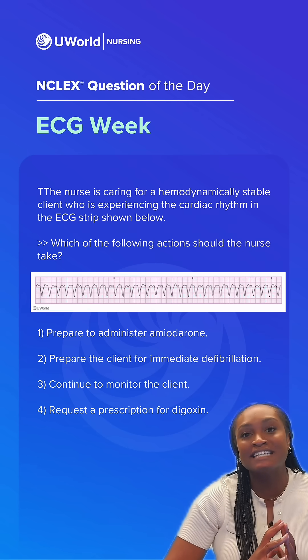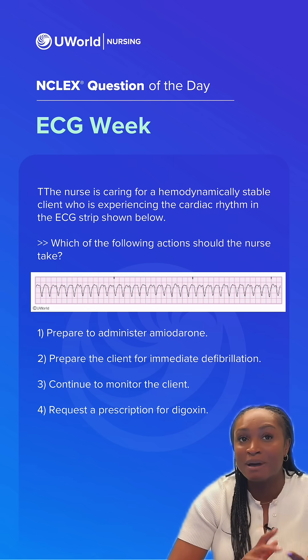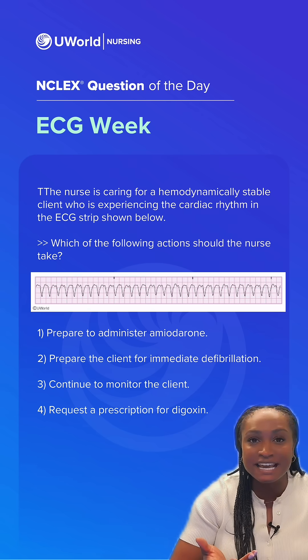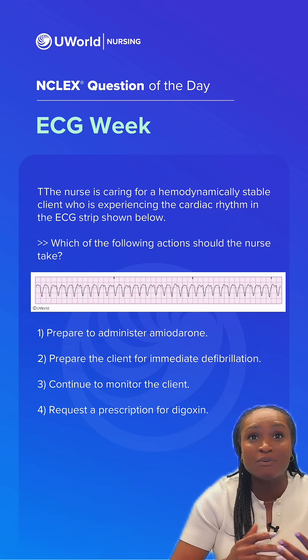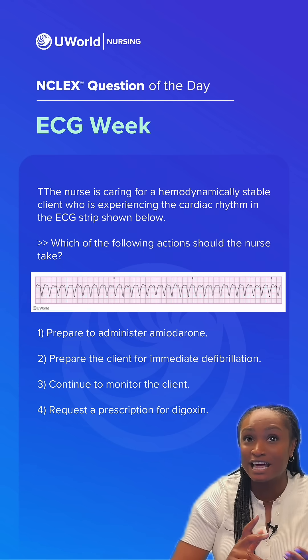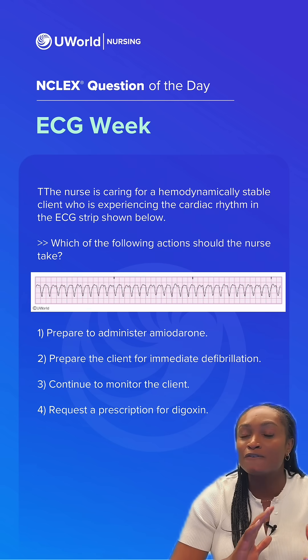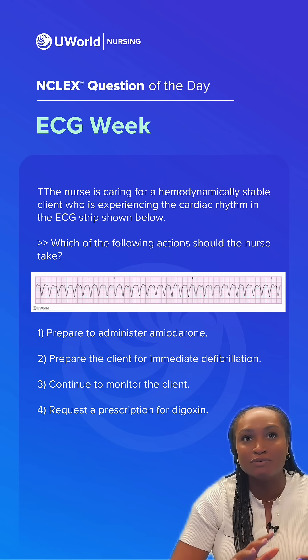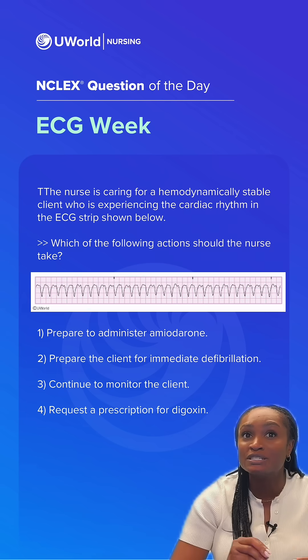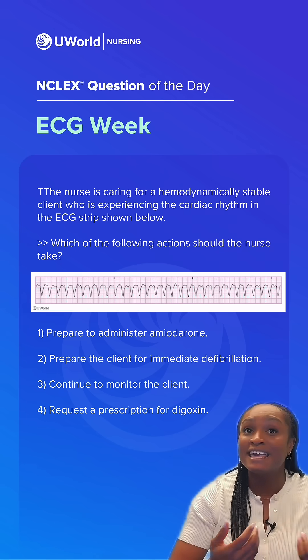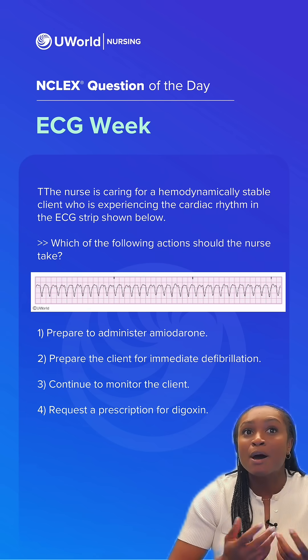So let's first identify the rhythm. I don't see any P waves, and what I do see that look like QRS waves look fast and abnormal, so I know it's going to be a ventricular rhythm. In this case, it's V-TAC.